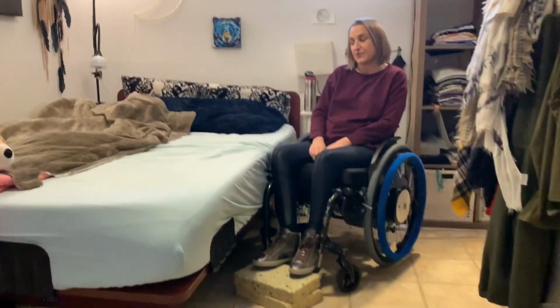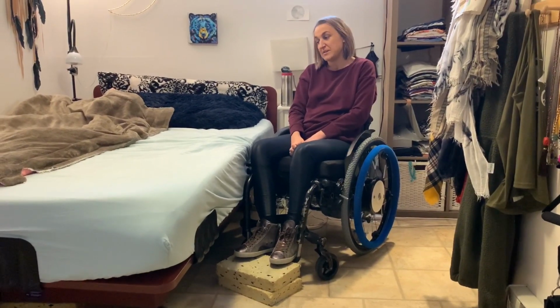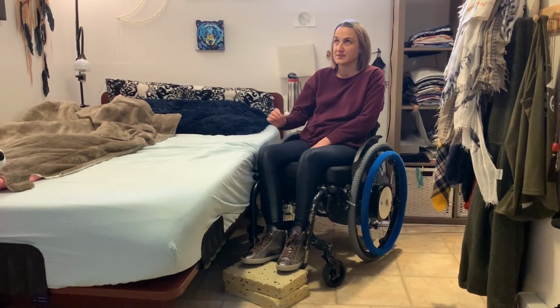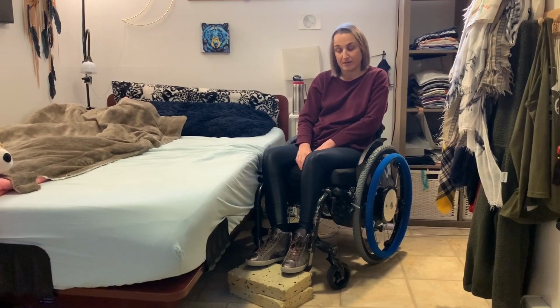Okay, and now transferring without a board. So basically transferring took me a little while. With a board, I don't even remember, maybe a year and a half to really master that. And then maybe it took me 3 years to be able to transfer without a board. I transfer on most places without a board unless the gap is too big. So anyways, it's just time, practice. Also depends on your level of function and your strength.